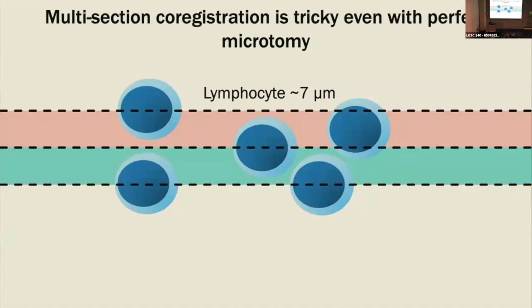And unfortunately, correct me, is this right, Albert? It's only breast cancer cases where there is a requirement on how long the tissue is allowed to be ischemic before it's processed. Otherwise, is that right?